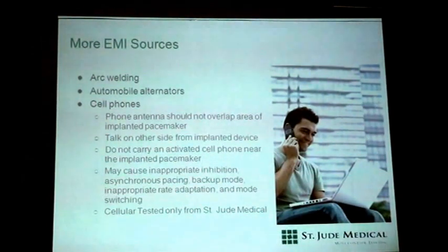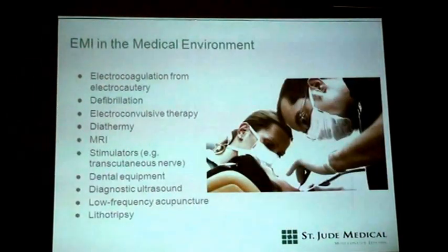But commonly this is the situation. Use the ear on the opposite side of the pacemaker and keep the phone in the pocket on the other side. This is the guideline we give the patient: keep it as far away from the pacemaker as possible.